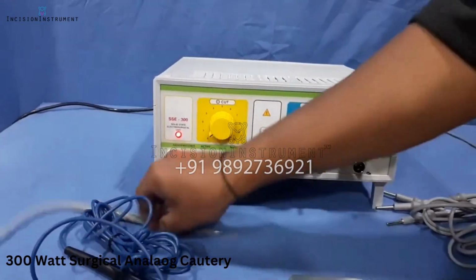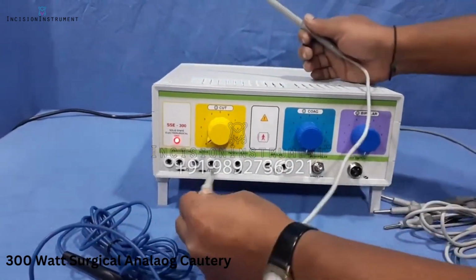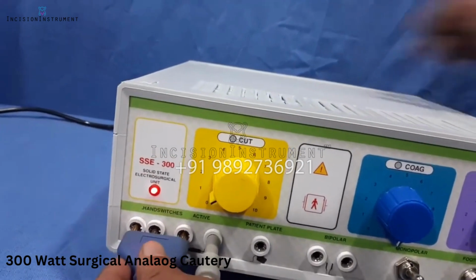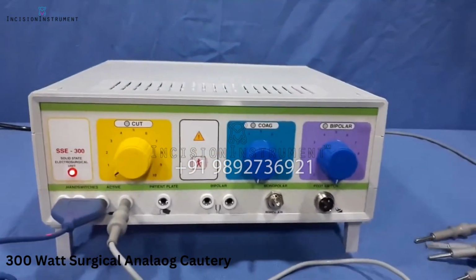In this you will find the active handle, which we have provided with the machine. Here there is an active handle port. On the left hand side you will get a hand switch. Here you have to connect the hand switch.